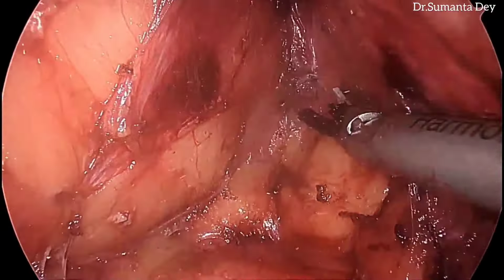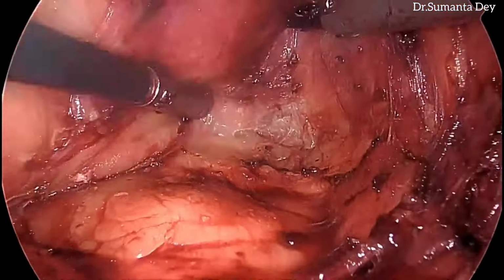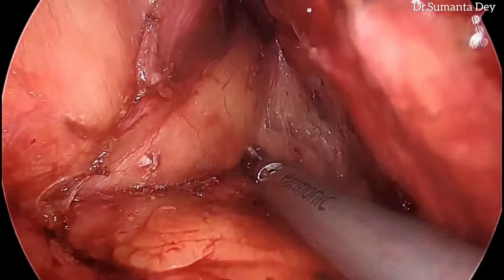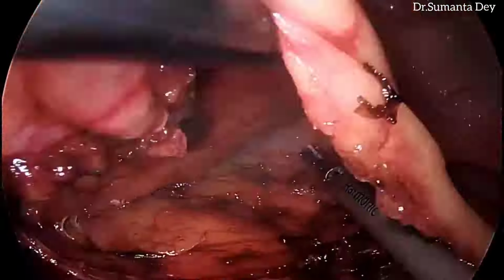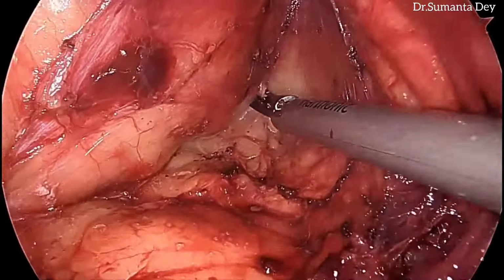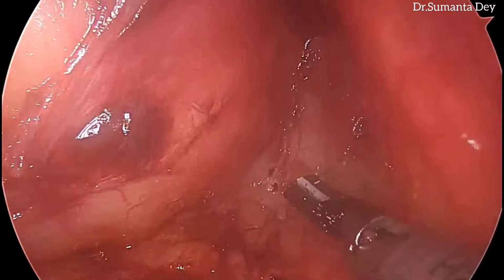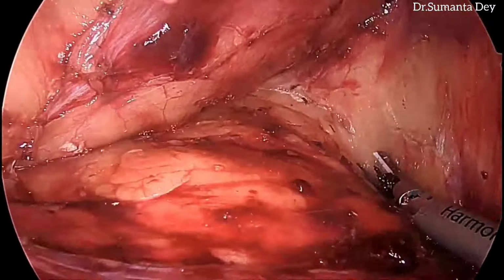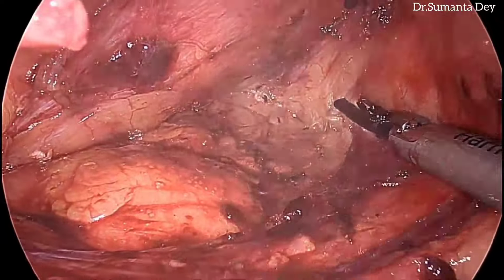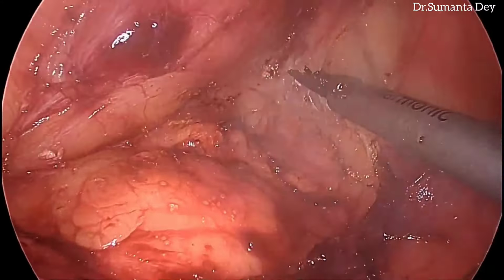Medial to lateral dissection is continued till we get a vision of the left colon, or reach the left lateral abdominal wall, following the same plane without entering into the Gerota's fat. So maintaining this plane is very important. You can see a clear, intact mesocolon is lifted off and there was no breach. That is how a complete mesocolic excision should be done.